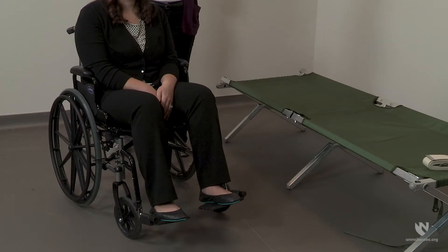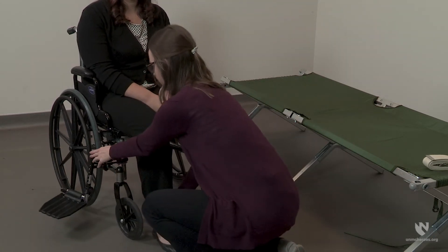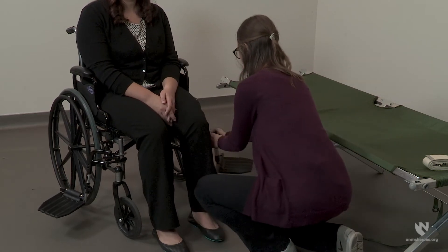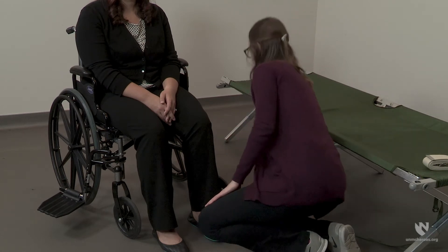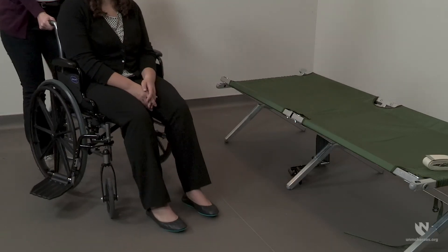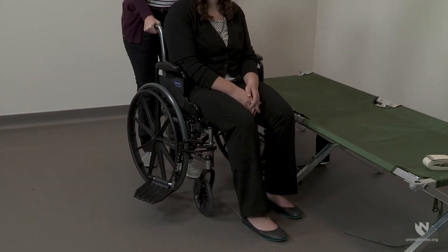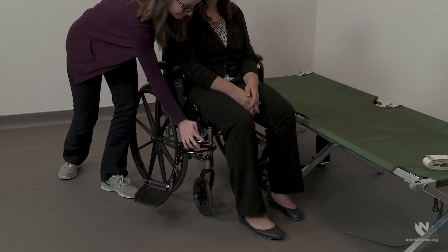Position the wheelchair several inches from the side of the cot. Swing the footrest away on both sides. Then remove the footrest from the side closest to the cot and place it somewhere where it will be out of the way during the transfer. Move the wheelchair as close to the cot as possible and at a slight angle. Finally, securely apply the wheel locks.